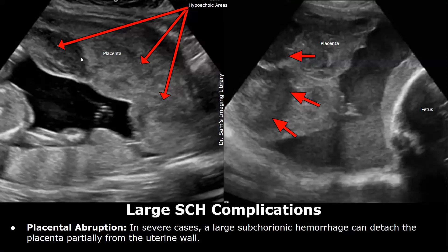The placenta will have hypoechoic areas. It is very irregular in shape and heterogeneous in appearance. There is a large hypoechoic and heterogeneous area in and behind the placenta indicating placental separation.